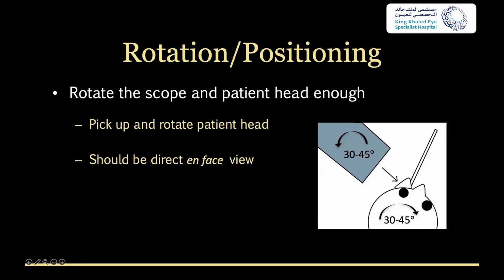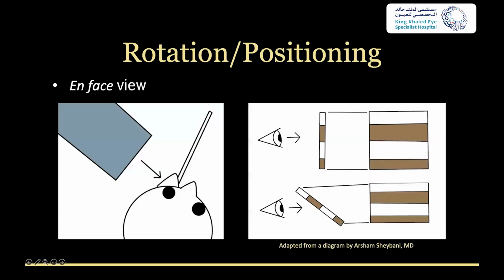So I find that if I just tip the patient's head a little bit at the side, they'll often kind of slowly rotate it back. So I actually will end up lifting up the patient's head, rotating it, and then setting it down again. And for whatever reason, they seem to stay in that position a little bit better. And again, you're looking for this en face view.